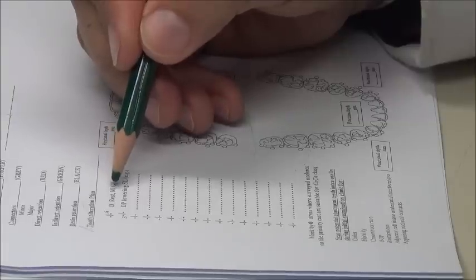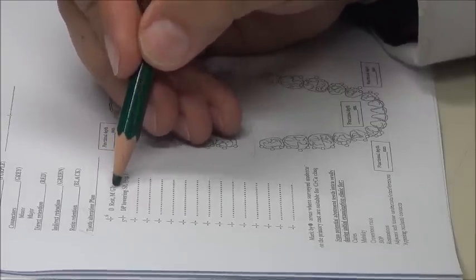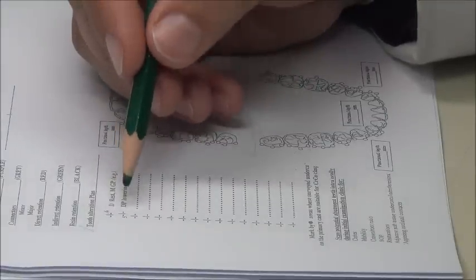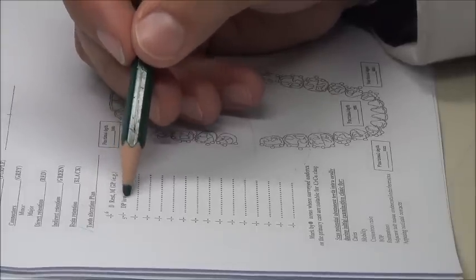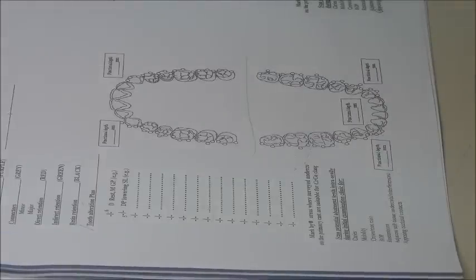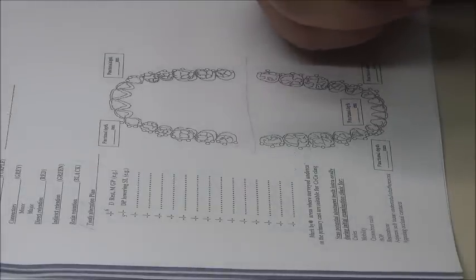Okay. So upper 6 we have a distal rest, and we have to prepare for a mesial guide plane. Some teeth you need distal lowering of, for example, distopalatally, you need to lower the survey line, okay? So these are types of preparation and how you write them. So sometimes one tooth will have multiple preparations, or you'll have multiple teeth other than the abutments to have preparations in, okay? Especially if they have interferences.